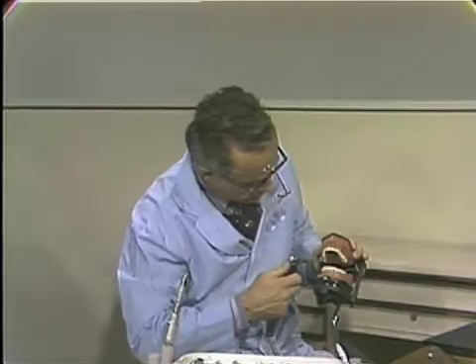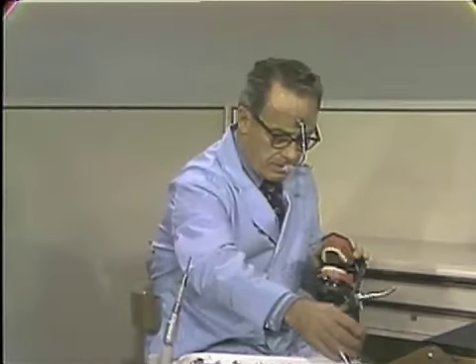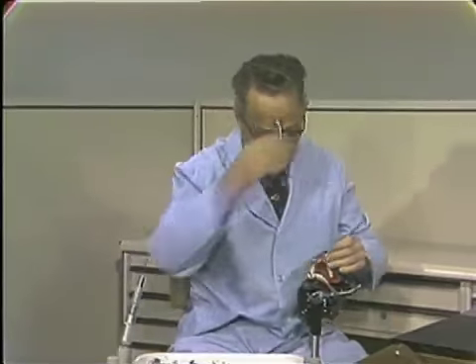After removal of the debris from the prepared cavity with a chip syringe, we will then reposition the patient so that we now can look into it a little better, and also we can finish up the bevels that are necessary for this preparation.